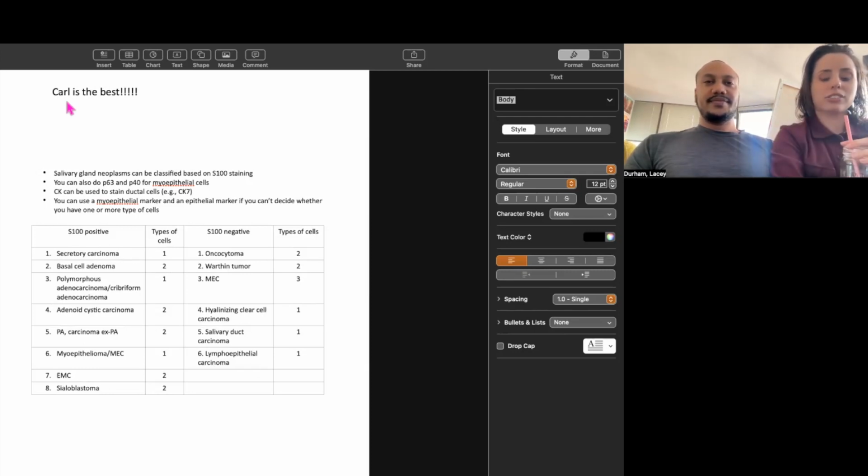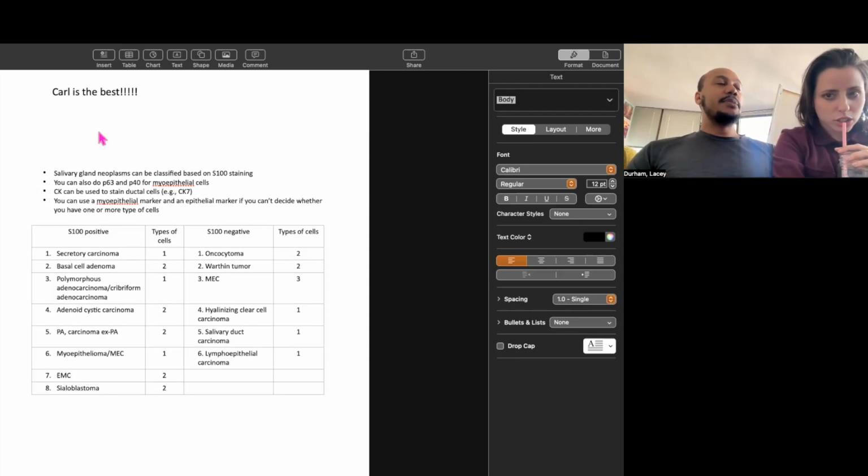I know that he has used this. Do you want to share the case? Yeah. We had a case 2 days ago. We looked at it. I was pretty confident on cytology. We get the core. What did it look like microscopically? So on the cytology smear.